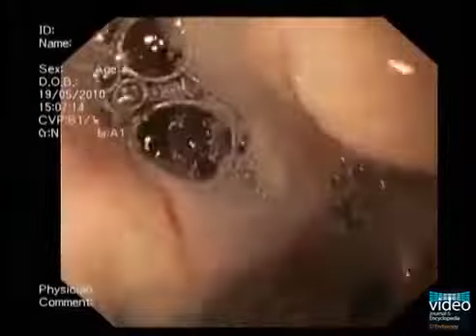Following injection of diluted adrenaline, most clots are easily removed using irrigation, suction, a biopsy forceps, or a snare in case of larger clots.